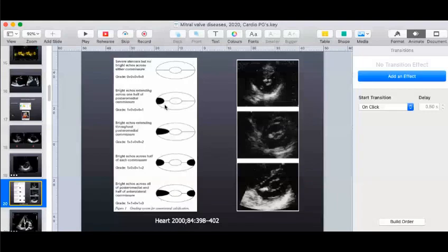For this you need to angulate the short axis a little bit back and forth, because you generally find it difficult to get both the commissures at the same level. So you may need to tilt the probe at a different angle. But what you need to observe is whether it is partial or complete calcification, whether it involves both commissures, and whether part of it is still not calcified.